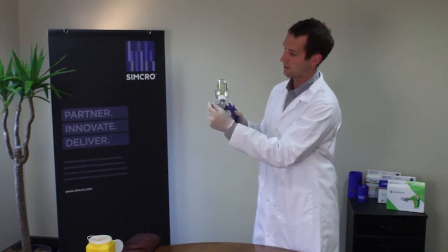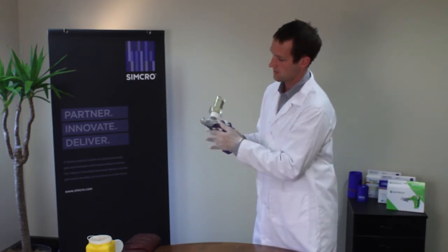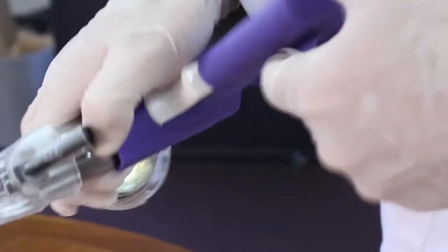And if you have a needle that's not sheathed, we can do that as well. Simply go through the process: turn it up, there's a button for the needle guard — press that down and the needle guard comes off.